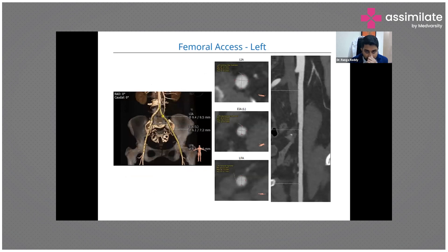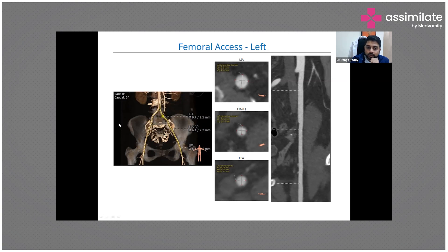This shows how we assess the femoral axis. We evaluate the area of the femoral axis, whether there is any tortuosity, where exactly we need to pass through, any calcification involvement, how high the bifurcation is - all these things are assessed in the CT.